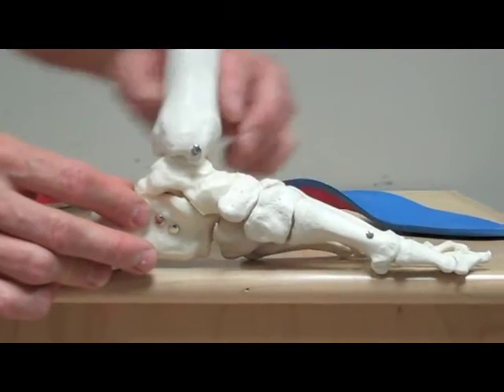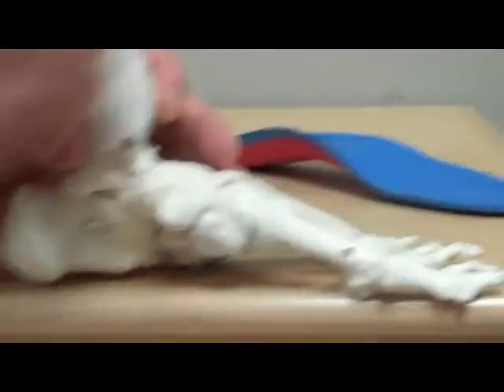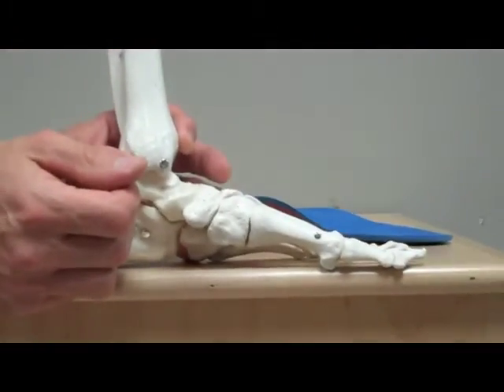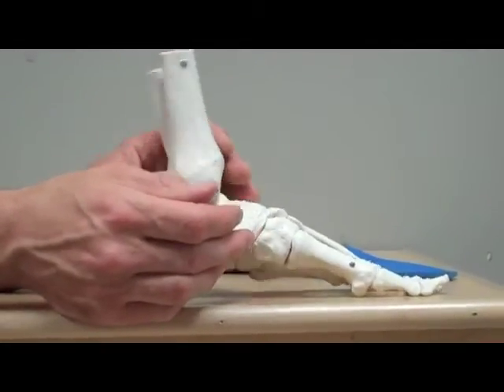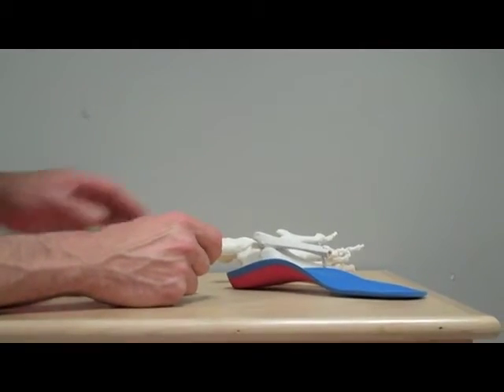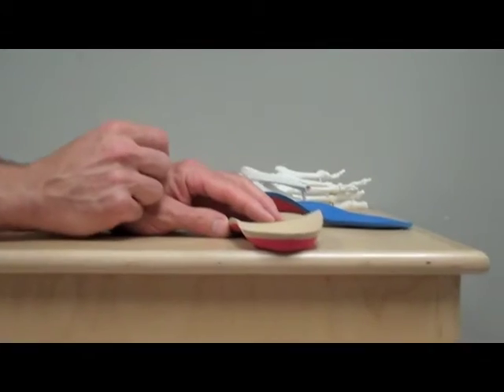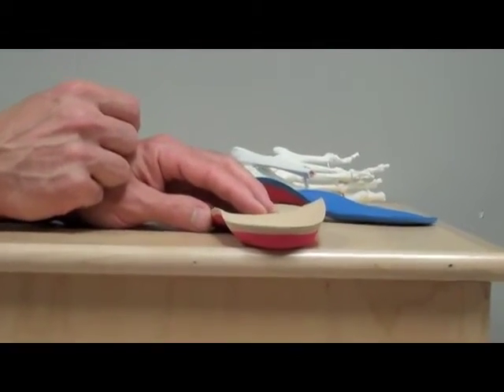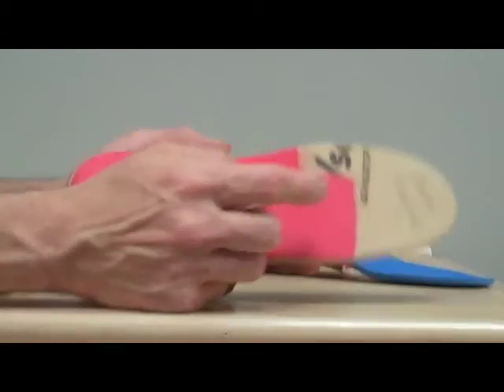But like I said, the evidence definitely plays out to the fact that the post that we did here takes the pressure off that fascia. And that's work that was done by Kogler and his group. And then as far as another option, you can actually go with more of a neutral heel over here. And then what I did over here, just as another option, you can actually do a post between 2 and 5.